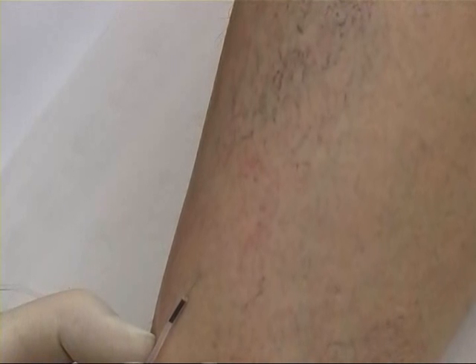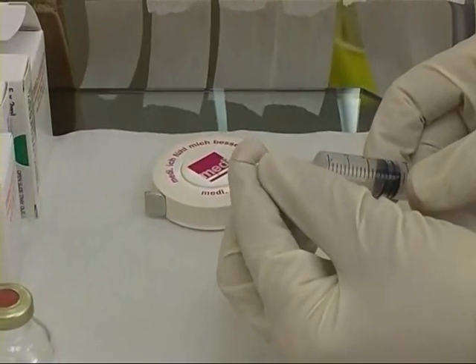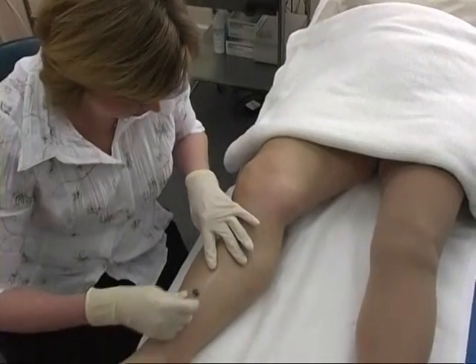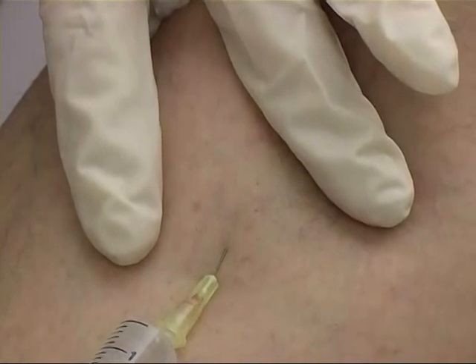Treatment commences with injection of a reticular vein, which is considered to be one of the feeders for the patch of telangiectases. These are effectively filled by injecting the feeder vein. This sclerotherapist is going to use a 30 gauge straight needle, angulating it to facilitate injection of superficial varices. Again, reticular varices are injected before telangiectases.